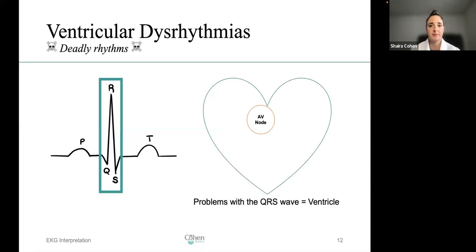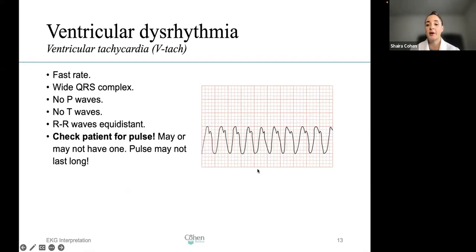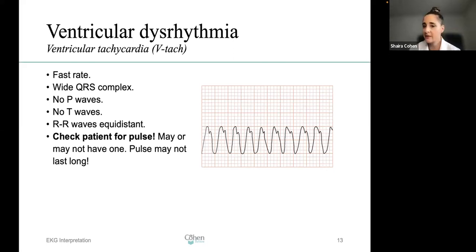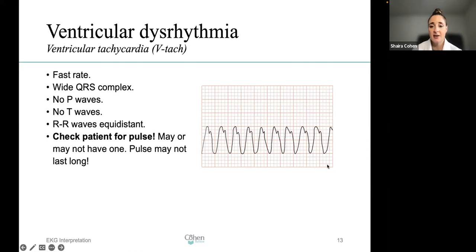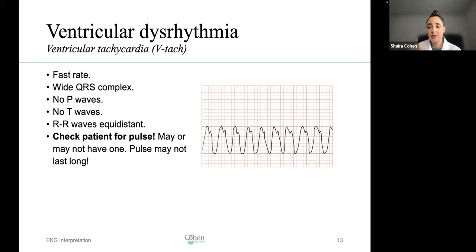Ventricular dysrhythmias — these are dangerous. Now we're looking at the QRS complex and the AV node, which activates contraction of the ventricles. Ventricular tachycardia (V-tach): because it's tachycardia, it's a fast rate. There is a wide QRS complex. You won't see P waves or T waves. The R-to-R waves are equidistant. The key thing: check the patient for a pulse — they may or may not have one. If you see large waves with no P or T waves forming a clean PQRST complex, think ventricular tachycardia.